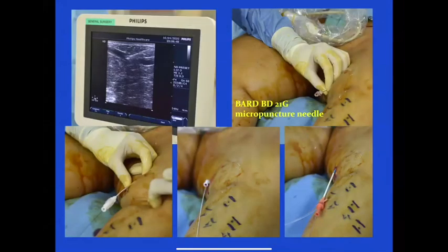I always start with a micropuncture technique. When I started learning endovenous techniques in Cambridge, we used quite a large needle, but for our population of patients with small veins, I always like to start with a 21 gauge needle and then build up. For the endovenous microwave ablation, we use a micropuncture set and build up to a 7 French sheath, very much similar to RFA.